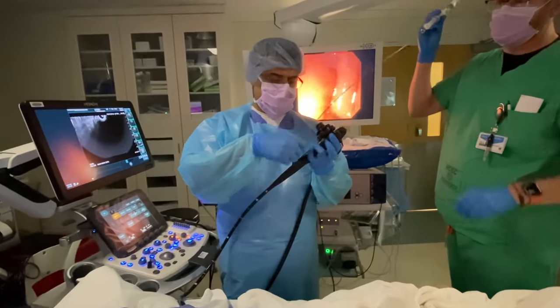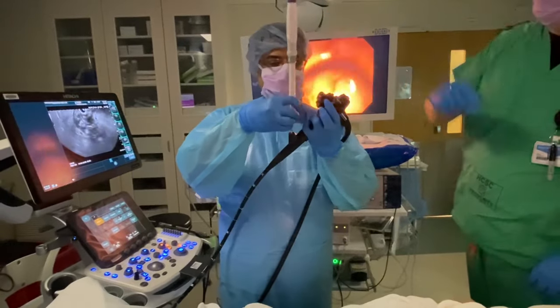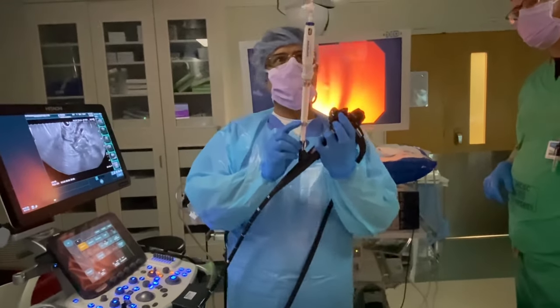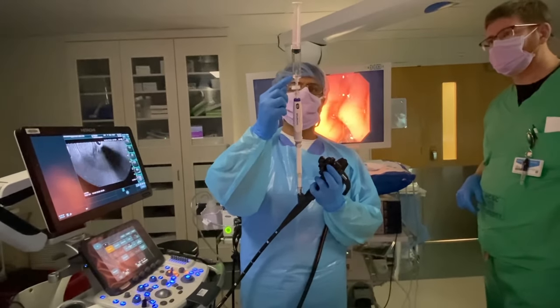The needle is then passed down the linear echo endoscope, the sheath is adjusted at one and a half centimeters, and the suction syringe with the two cc's of water is checked.